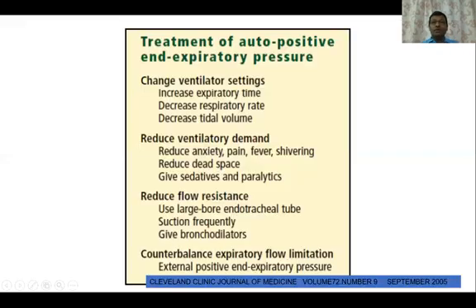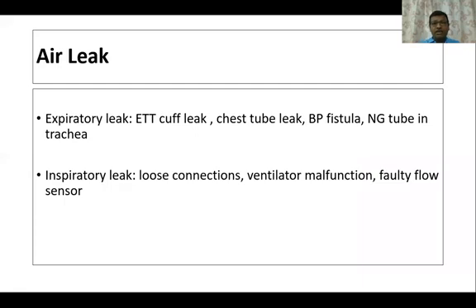Now, how are you going to treat auto PEEP? You can either change the ventilatory settings, that is, you can increase the expiratory time, decrease the respiratory rate, or decrease the tidal volume. You can reduce the ventilatory demand by reducing anxiety, pain, or fever, or giving sedatives. You can reduce flow resistance by putting a large bore tube, or you can counterbalance any expiratory flow limitation by external PEEP. So now the next problem which we can identify with graphics is air leak.